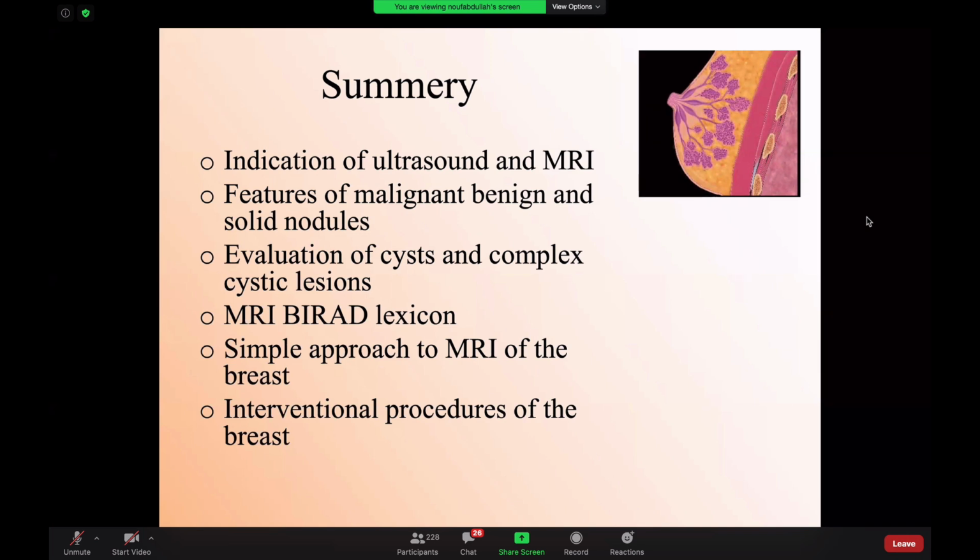Okay. Dr. Omar is asking, what is the best modality to start with in young versus old, males and females, and why? Generally speaking, for a female below 40, I start with ultrasound. If I see it's suspicious, I proceed with mammography. In males, generally, I like to do ultrasound. Again, most of the time it's gynecomastia, so I don't need to expose the patient to radiation. If I'm not sure, then I would proceed with mammogram.